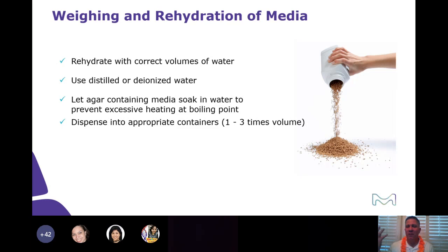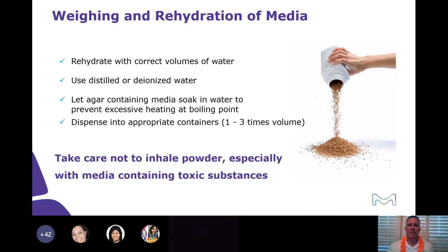Flowing over the top. It was a very good exercise in what not to do as a dumb kid. But you just want to make sure that you have a safe with a spinny hot plate and the right type of Pyrex containers. And you don't want to inhale the powder.